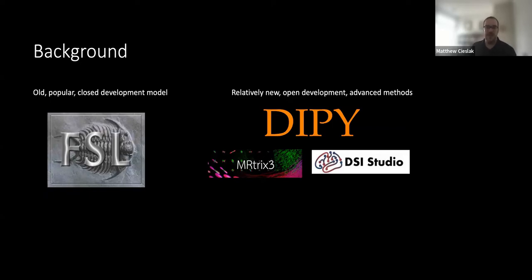And we wanted to make sure that we could take all of these, use them interchangeably, and make it so that someone who only knows the metadata about the data they collected could read about a method and then find its implementation in QSIPrep and be able to run the workflow without needing to worry about converting directions between software, or managing file formats, or skipping one of the steps that's in one of the many tutorials available online on how to do these large, convoluted pre-processing pipelines.